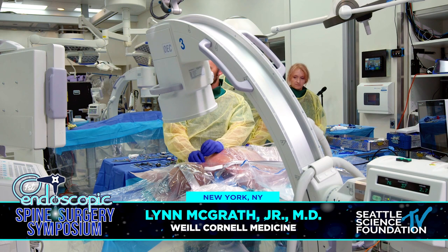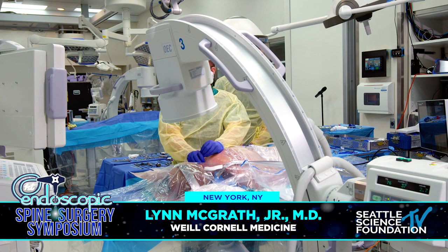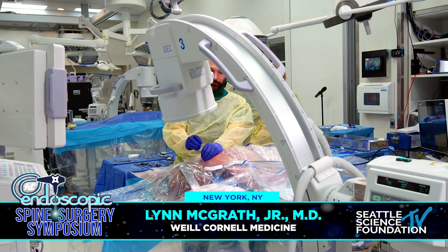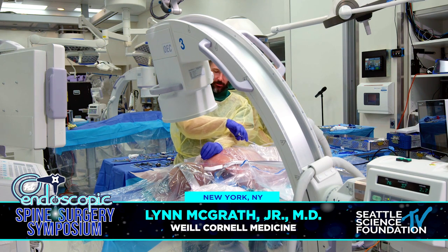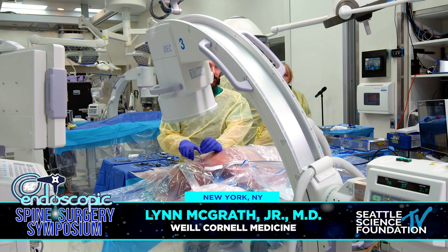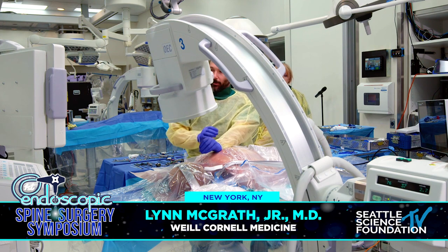Thanks Dr. Hassan, Dr. Hofstadter, and Seattle Science Foundation for having us. We're going to do a cervical posterior foraminotomy anatomy here at the endoscope. There are a couple of different ways to get the case started, figure out where you're going to make your incision, and figure out where you're going to dock.